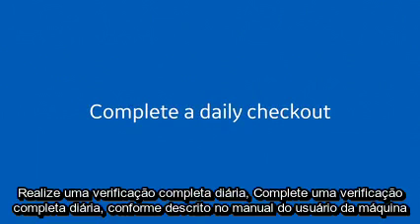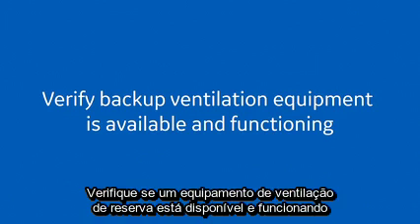Complete a daily checkout as described in the machine user's manual. Verify backup ventilation equipment is available and functioning.